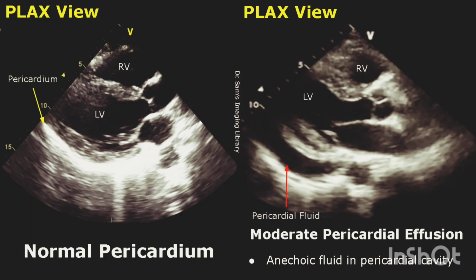Here is a case of moderate pericardial effusion. There is a larger amount of fluid in the pericardial cavity.